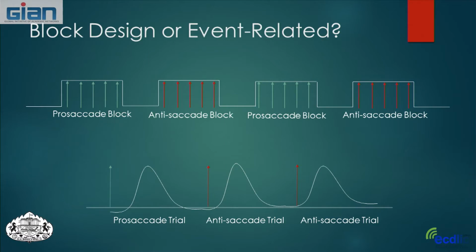Okay, so do we want to have this a block design or event-related design? What do you think? Okay, so this is kind of a trick question because you could do it either way. Usually in our saccade task, where we are looking at sensory motor, we use that as a block. Or you could do it either way.